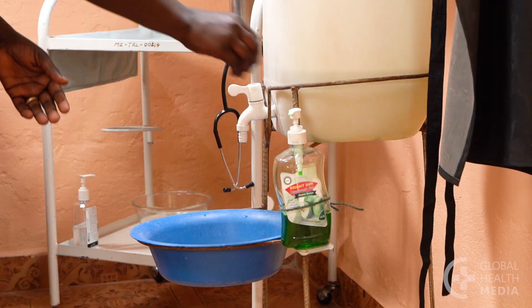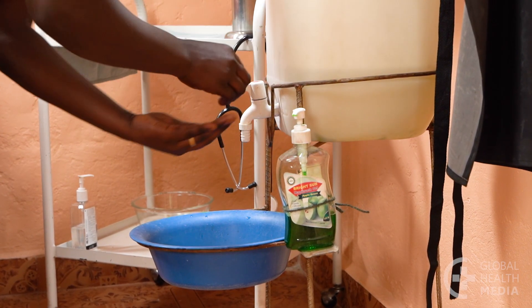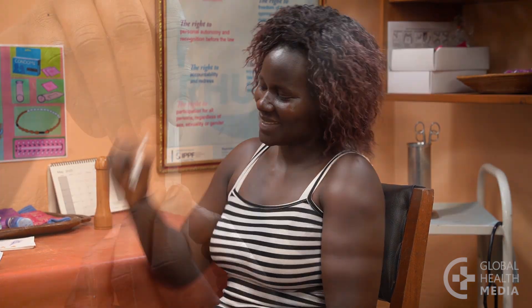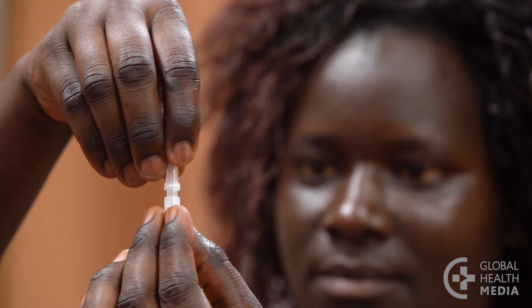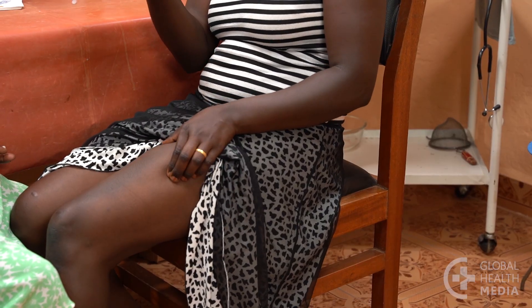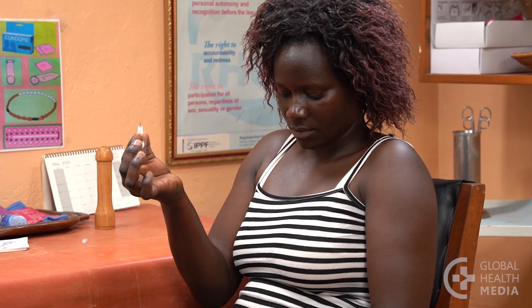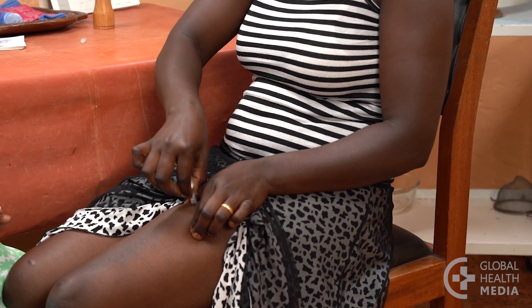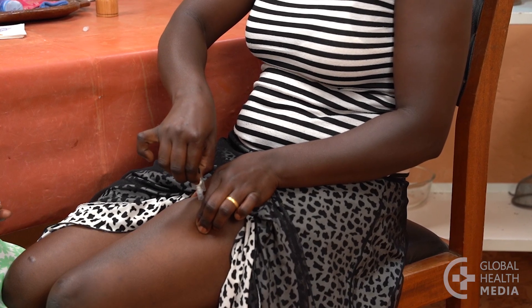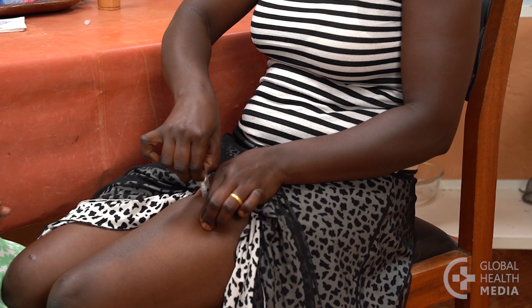First, have the woman wash her hands with soap and water. She may also clean the skin at the injection site if it's dirty. She shakes the device while counting to 30 to mix the medicine well. Then she pushes the cap and the port together to close the gap and removes the cap. Next, she holds the device by the port, then gently pinches up her fat tissue. She aims the needle down into her skin, inserts it to the hub, then moves her fingers up to the reservoir.